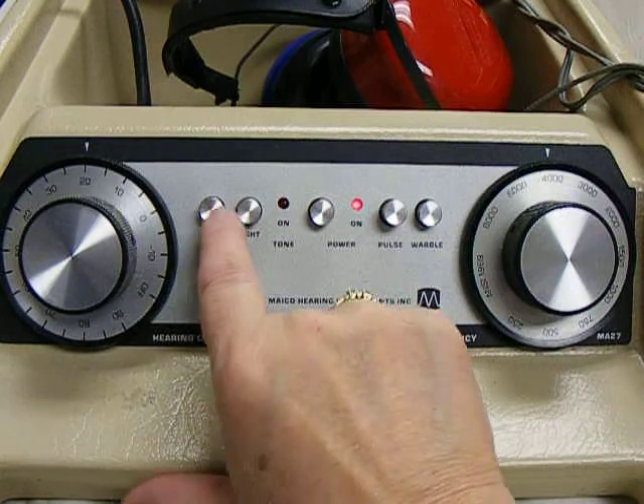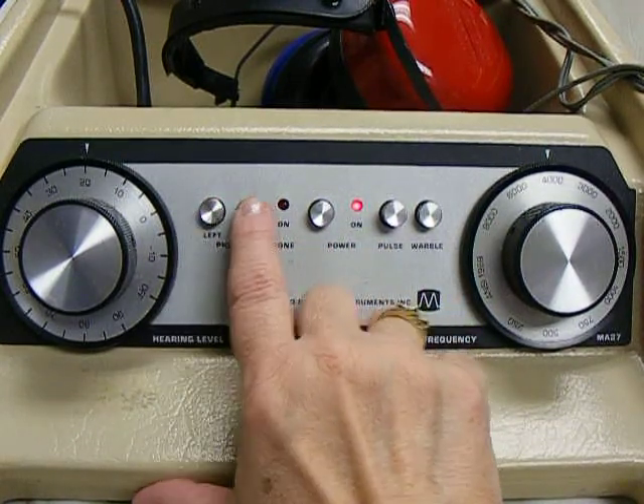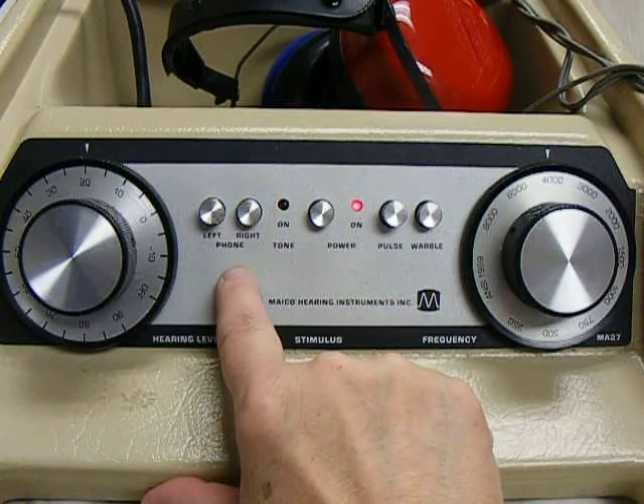These two buttons control where the tone is going — right ear or left ear. We always start on the right ear.